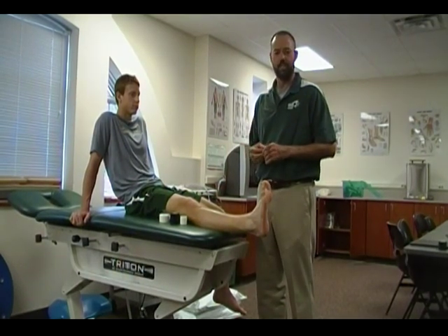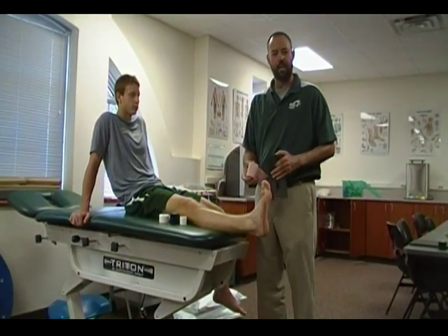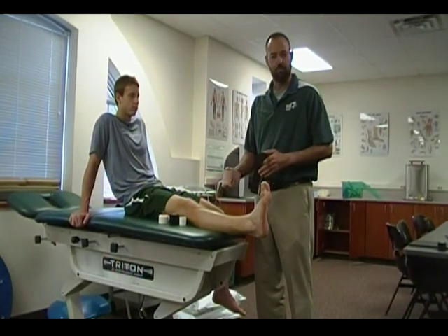Today I'm going to be demonstrating how to utilize a horseshoe and a three-inch elastic wrap to treat an acute ankle sprain. We'll be reviewing how to apply it, the direction of application, and also the taping procedure.